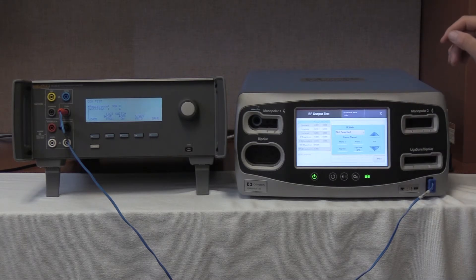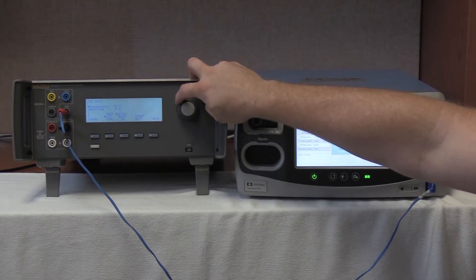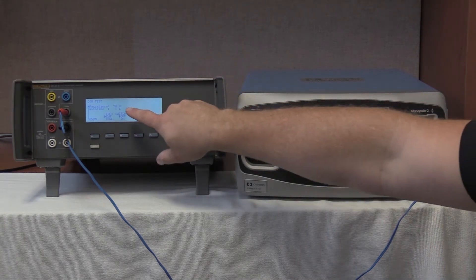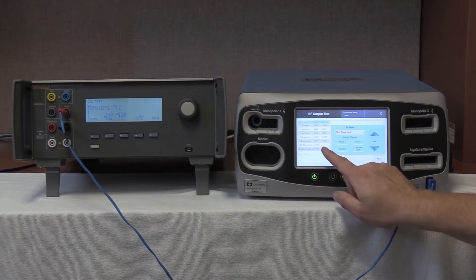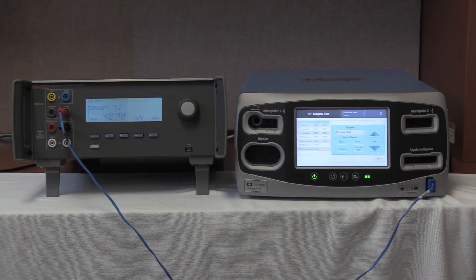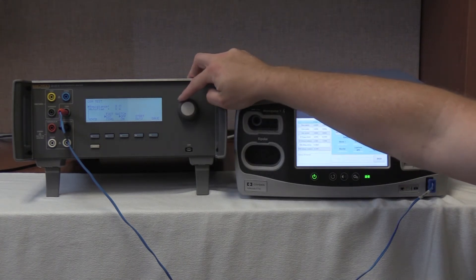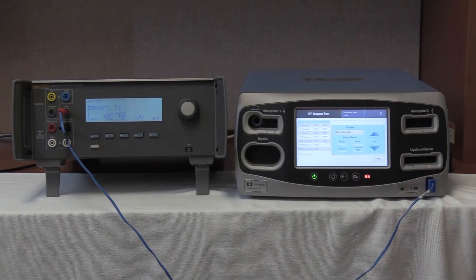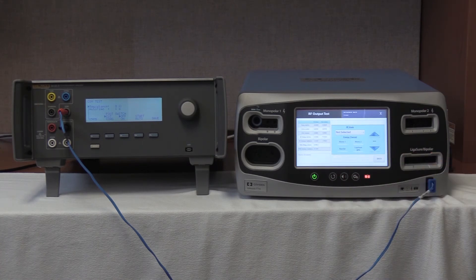We are now going to decrease the resistance to 50 ohms on the CQM test of the QES3. Once 50 ohms is selected, we will read on the FT10: we have 51.49 ohms — the tolerance is 43 to 57 ohms. Step 3 of the test is to decrease to 0 ohms, so we are going to decrease the QES3 to 0 ohms. On the FT10 we should read between 0 and 4 — we are currently reading 0.77 ohms, within tolerance.